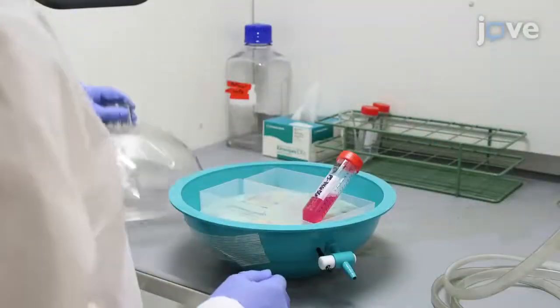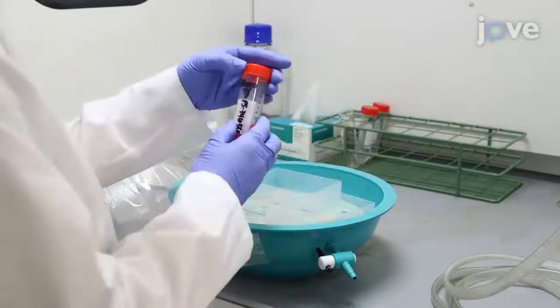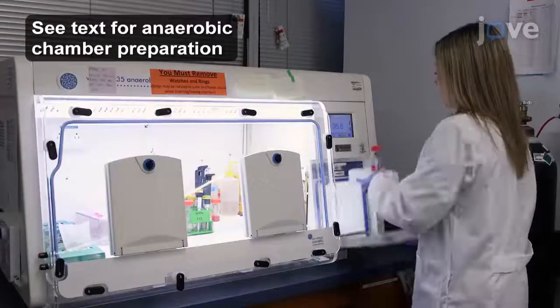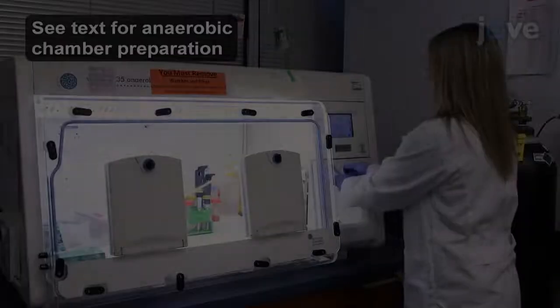Remove the tube from the bell jar and close the cap immediately to minimize introduction of air to the medium. Then place the tube for 24 hours in a prepared anaerobic chamber and loosen the cap.